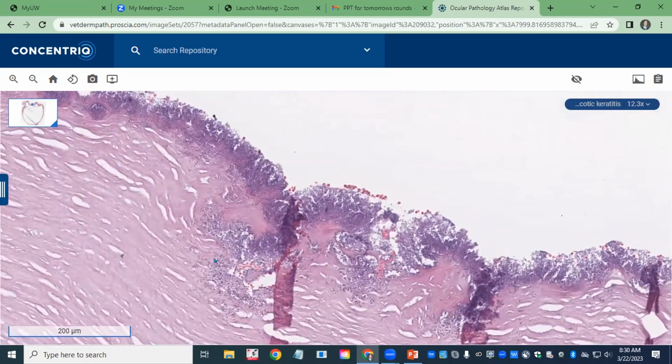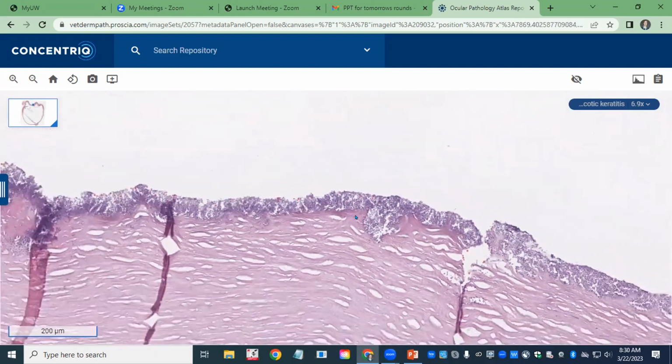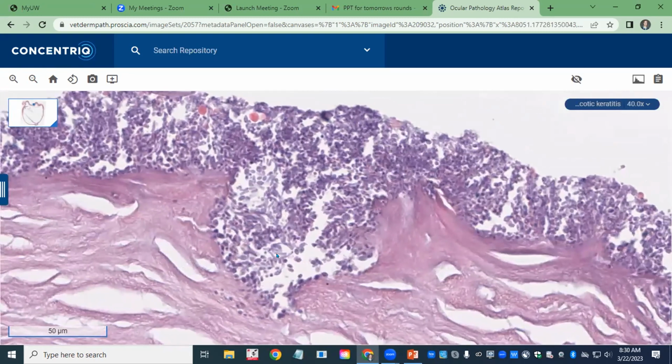And then rarely in the stroma, let's see if I can find one. Sometimes they actually form little hyphae, which I believe are pseudohyphae. There was a good example, but I don't know where it went. I found it last night. Is it annotated? No. Oh, well, we can check. I don't think it is. Anyway, in the stroma, they occasionally form pseudohyphae, and actually right here, there are some elongated ones.